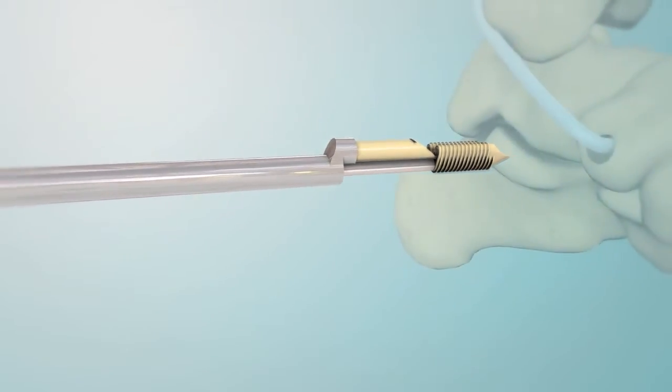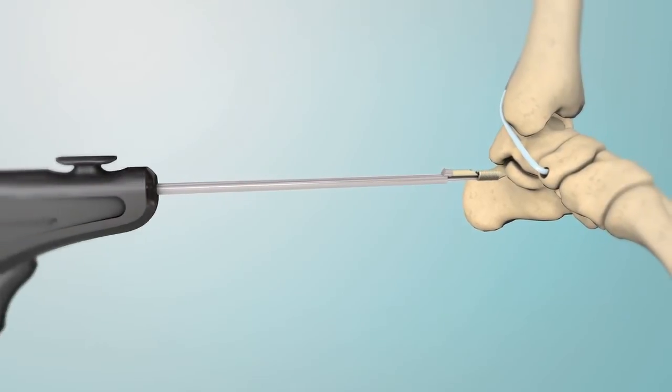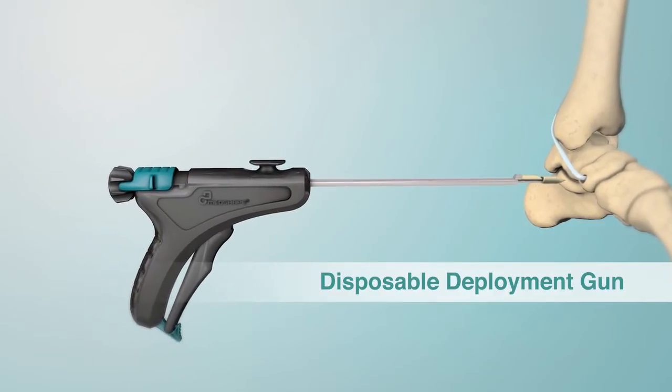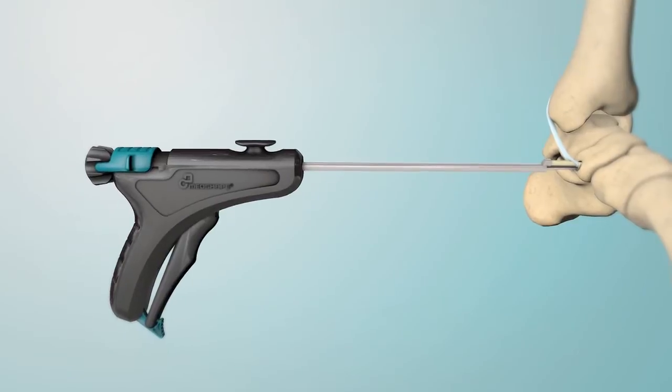The two-part Shape Memory Peak Altera device offers a quick, versatile method to secure soft tissue to bone. After placing the soft tissue into the prepared bone tunnel, simply insert the sheath using the disposable deployment gun.